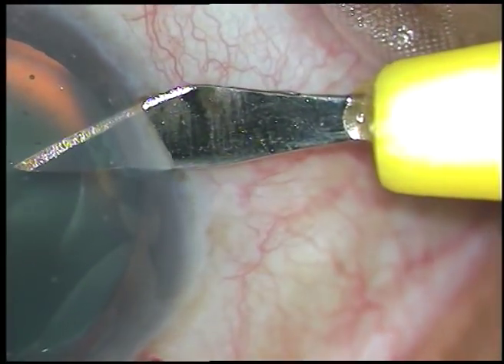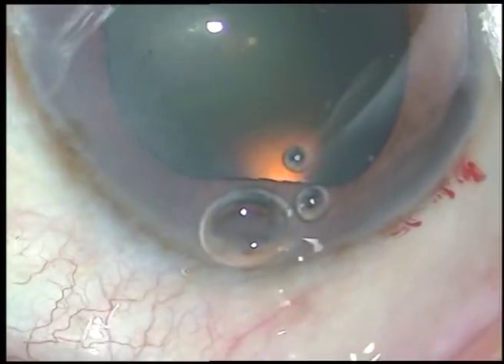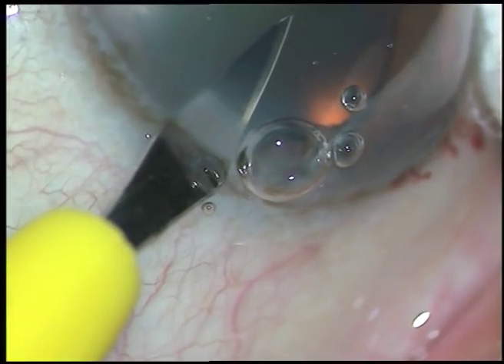Now this is the side port. All the incisions are at the posterior aspect of the limbus. That's it.